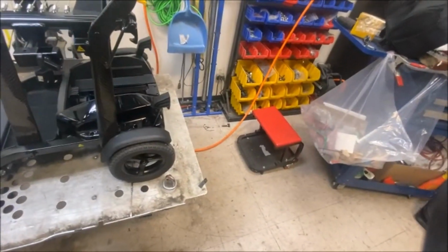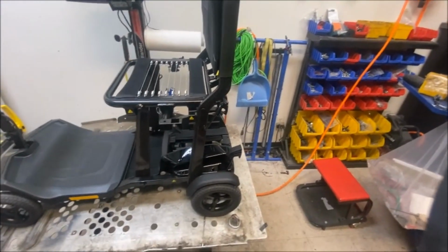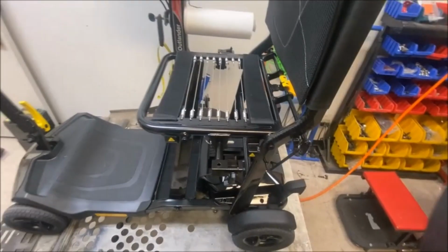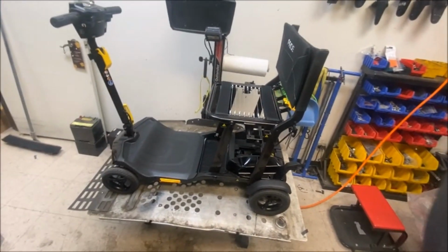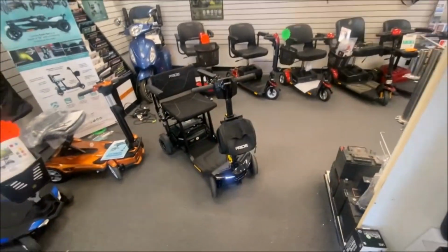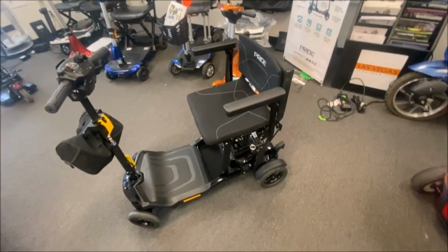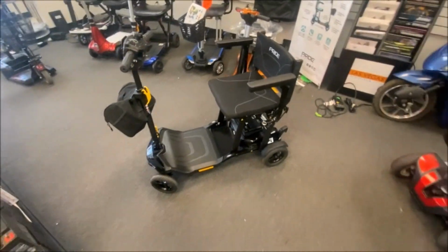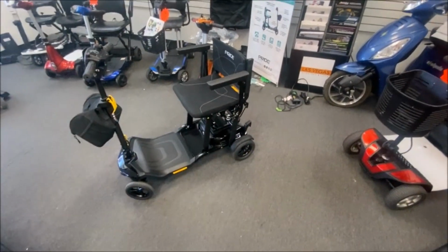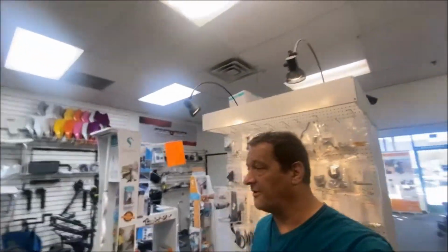So that's replacing this rear seat section on the Super Portable. Let me get it back together and put it back in the showroom and let the customer pick it up. It's all back together now, so batteries in it, bag's back on, all done. I've charged it for him. So that's how you replace the seat frame and the back of that. Bit of an ordeal. Not a cheap part, because it's carbon fibre, of course.